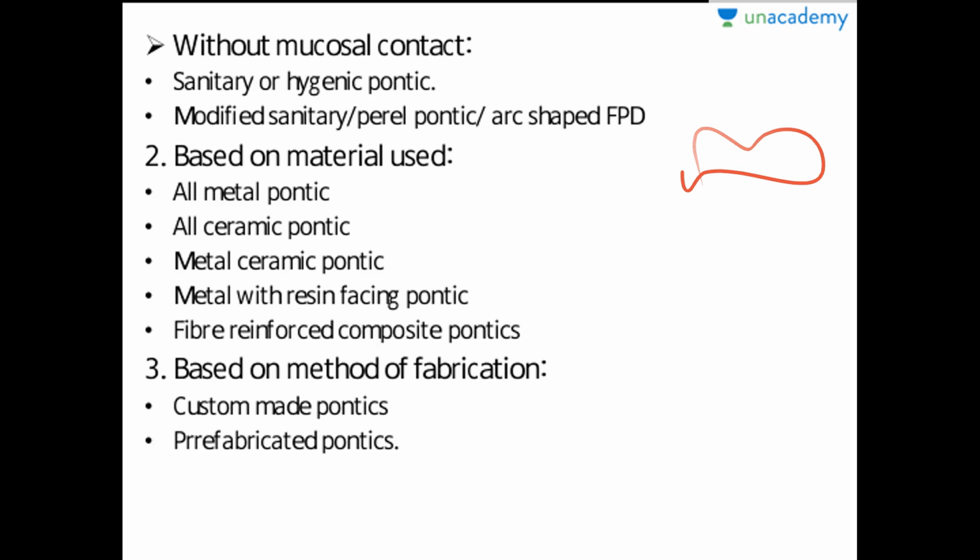Then based on method of fabrication, they can be custom made, that are made by taking the impression of the arch, and then there are prefabricated pontics that are prepared in different sizes and are available in the market.